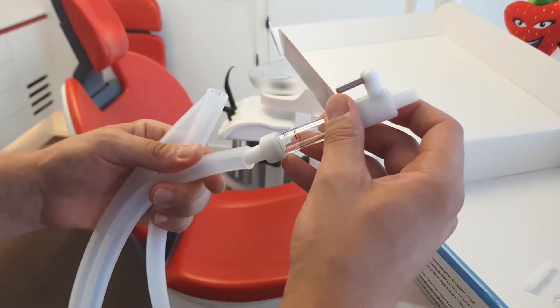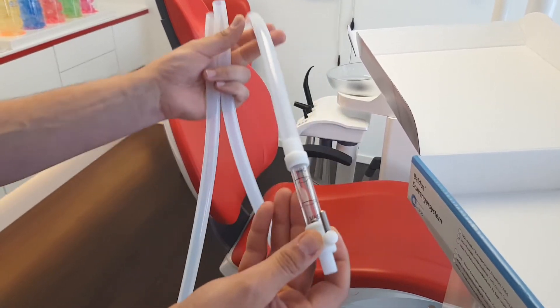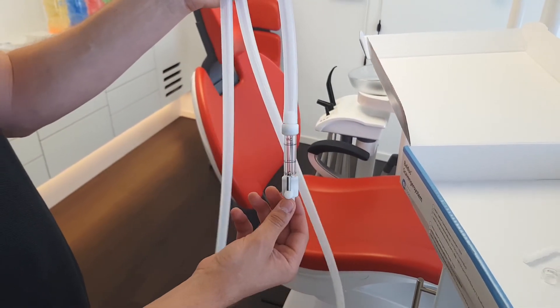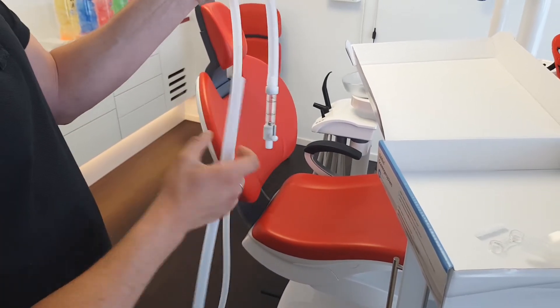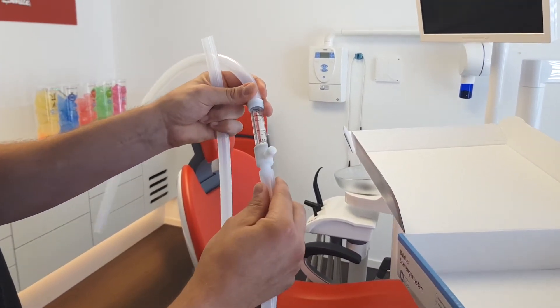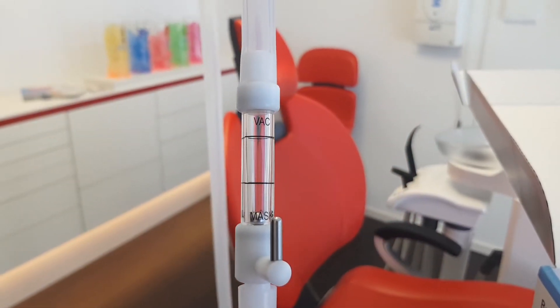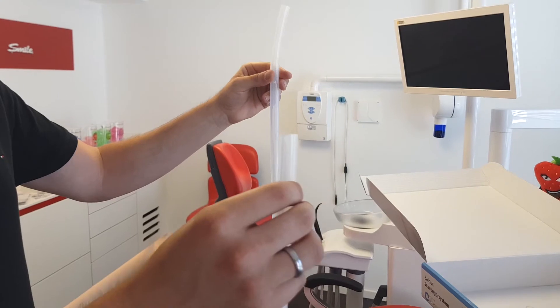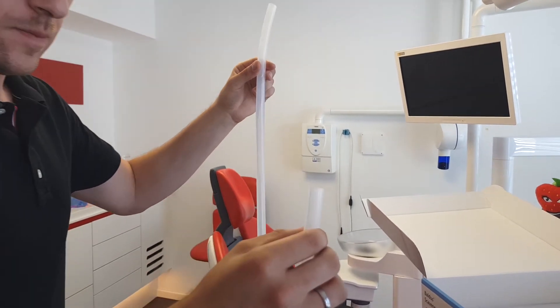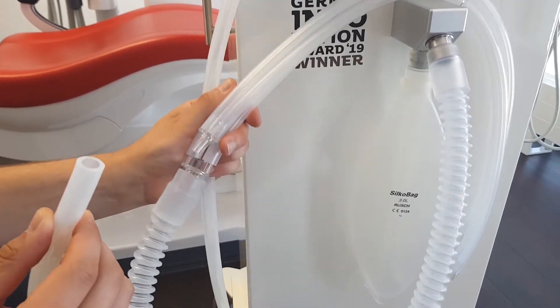The short vacuum tube should be connected to the top of the vacuum control block where it says VAC. The long vacuum tube should be connected to the lower end of the vacuum control block where it says MASK. The end of the long vacuum tube needs to be connected to the smaller Y connector on the double hose tubing.